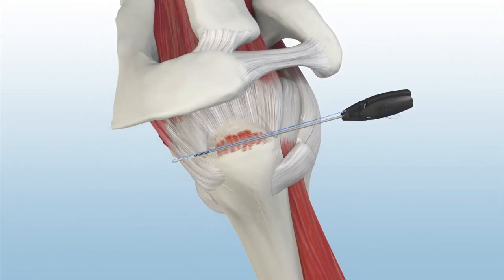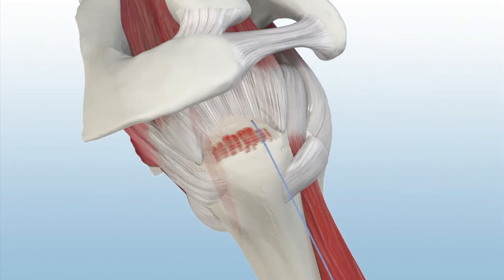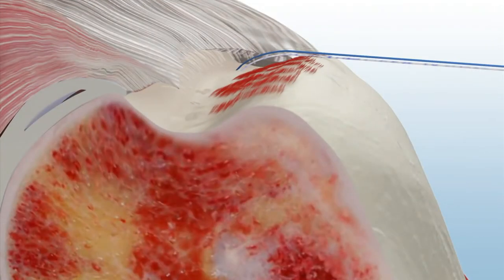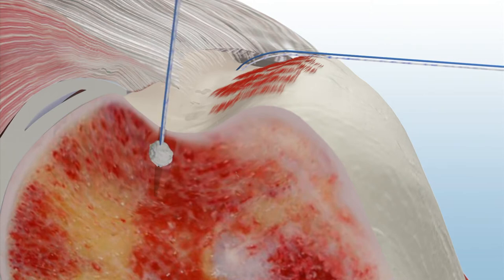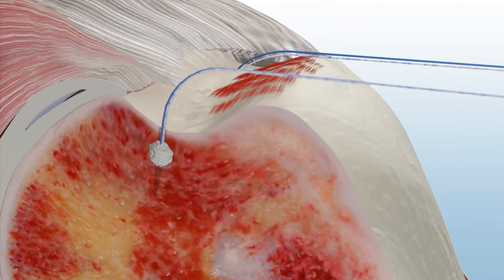A double-loaded Y-Knot RC anchor is inserted past the primary laser line and the inserter is removed. Pull back on all suture strands to set the anchor firmly against the cortex. A second anchor is then inserted. The Y-Knot RC anchor contracts vertically and expands laterally to provide 360-degree form-fit fixation.